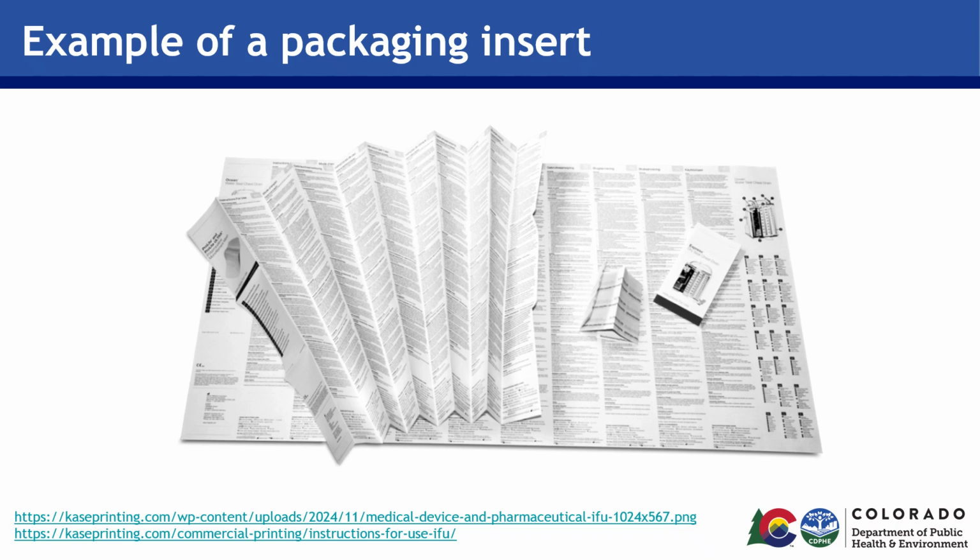Example of a packaging insert. Here's the last example of what packaging inserts can look like. These you will normally find within a package or box, and have fine print that are oftentimes difficult to read. Even so, be sure to keep this or get a version from the manufacturer that is legible to add to your library of IFUs.